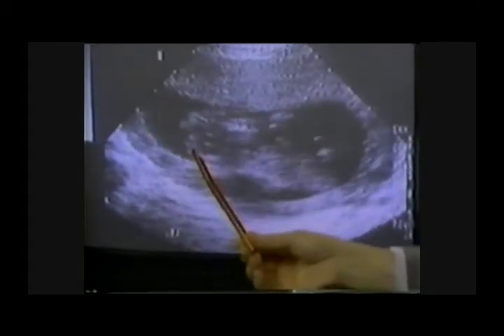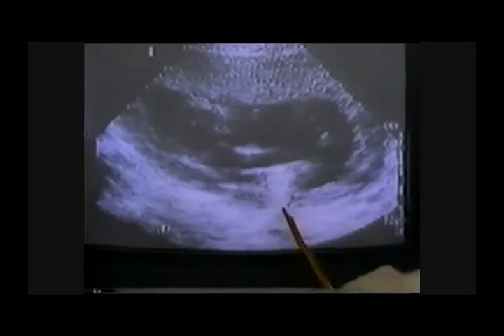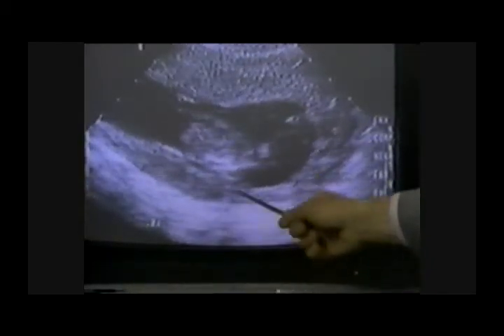Now, this shadow which we are seeing down at the bottom of the screen is the suction tip. We have colored the suction tip deliberately in order for you to discern it more clearly. But the abortionist has now dilated the cervix and is now inserting this suction tip, which you can see moving back and forth across the screen. You will note that as the suction tip, which is now over here, moves toward the child, the child will rear away from it and undergo much more violent, much more agitated movements.